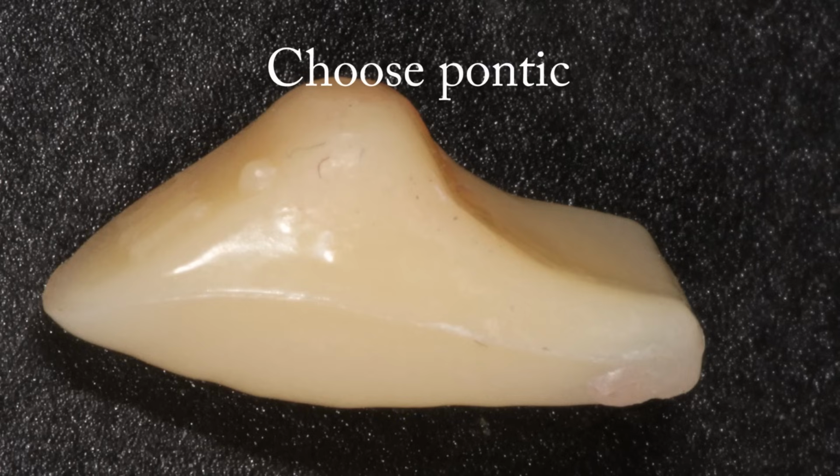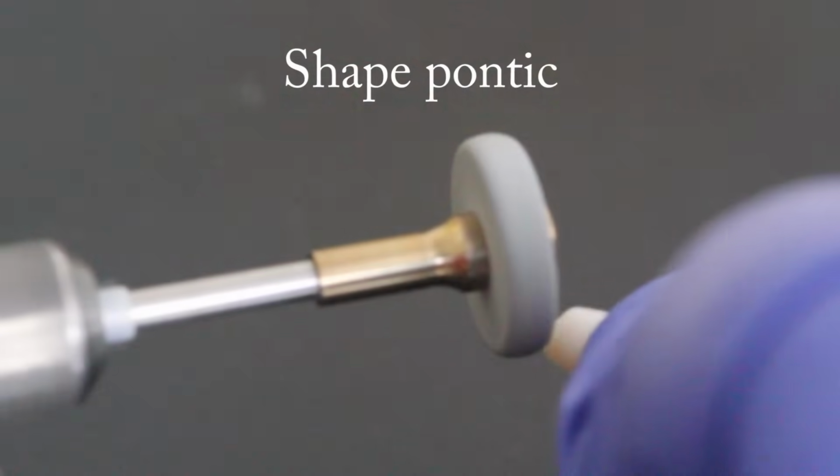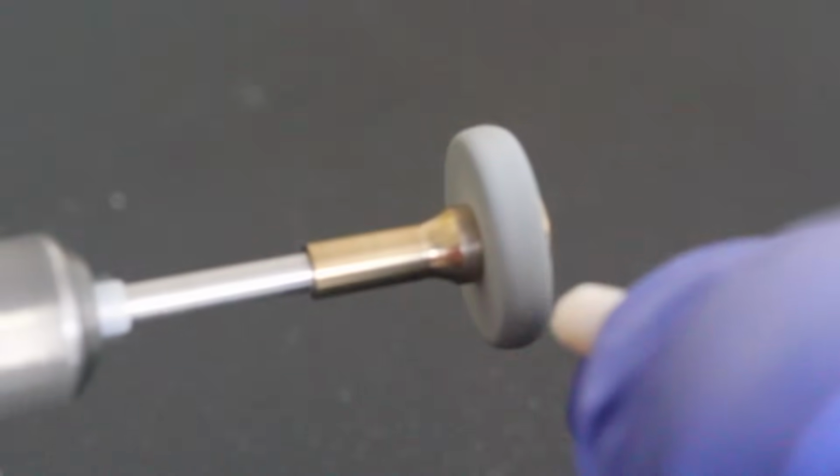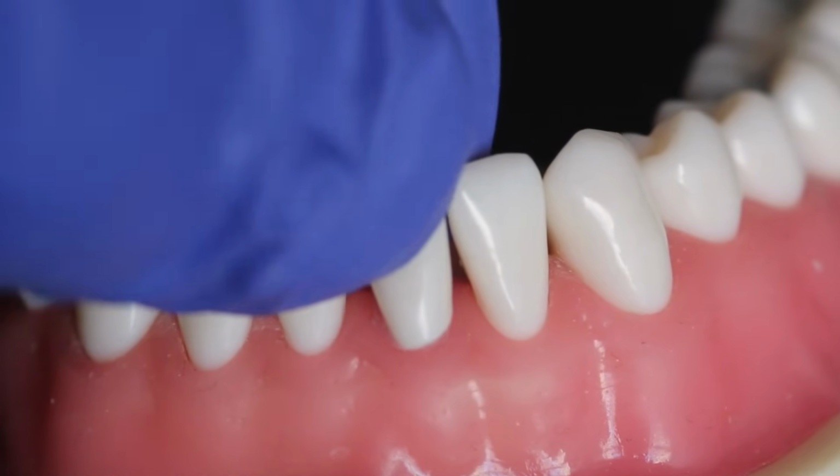First, you will need to decide what to use as a pontic. If you just extracted a natural tooth, you can use it as the pontic. You can also make a pontic using an acrylic denture tooth or a freehand composite buildup. You will want to choose and shape the pontic prior to making the ribbon framework.